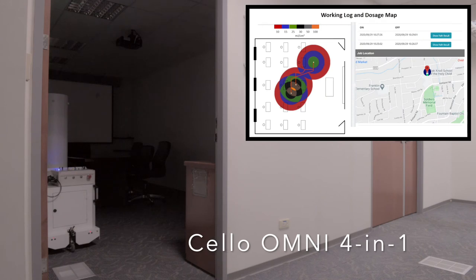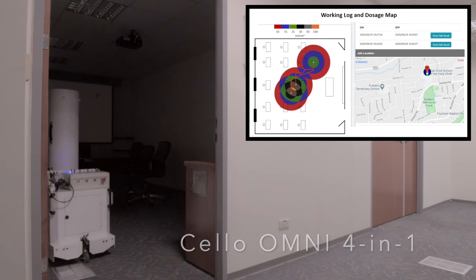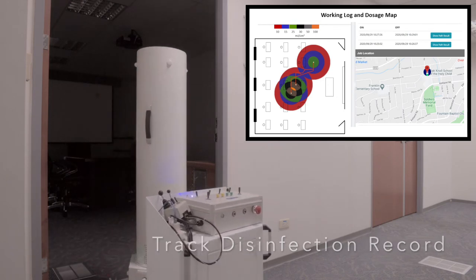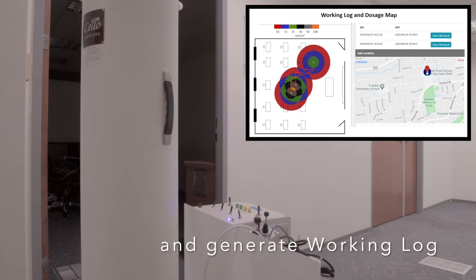With the help of the Cello UVC Robot, Cello Omni can record the tracking record of each disinfection trip and generate working logs on Cello Cloud.